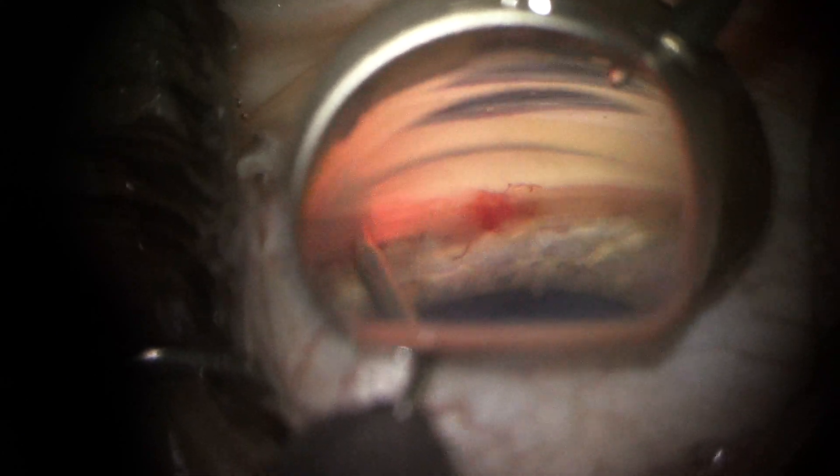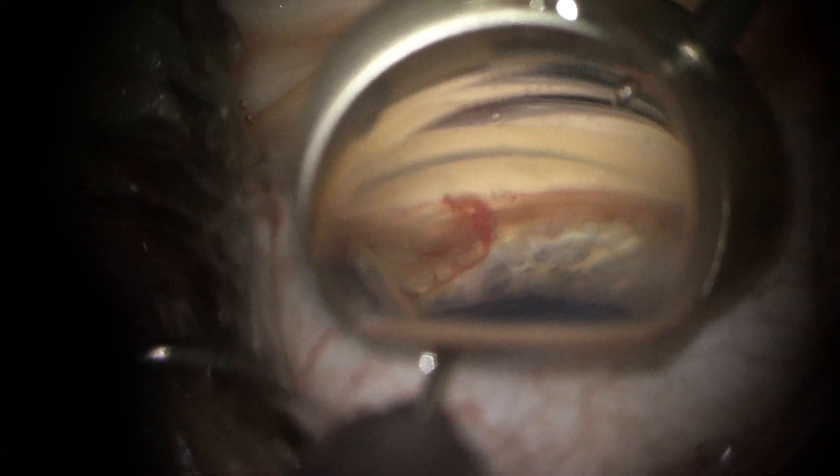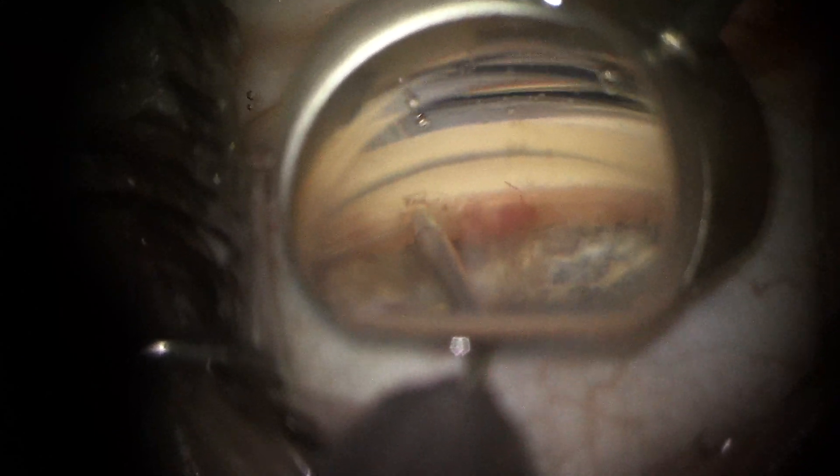After completing the 360-degree course of Schlemm's canal, I then reverse course and start pulling the catheter out with small jerking movements, because there is a tight fit between the catheter and the canal and these small movements allow me to move it more easily along the canal wall. As the catheter is being removed, it simultaneously injects a small amount of jelly called viscoelastic, which stretches open Schlemm's canal, increasing its capacity. This procedure is called a viscocanaloplasty.